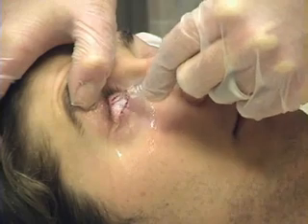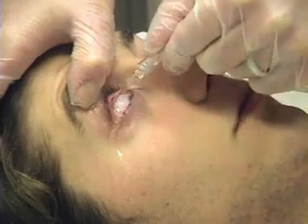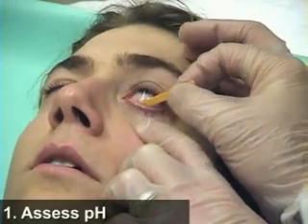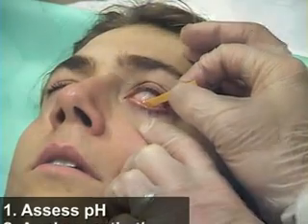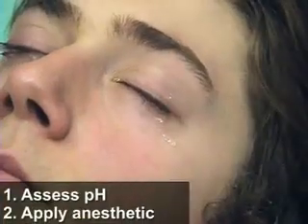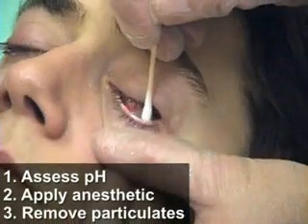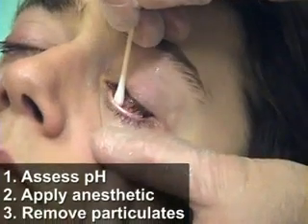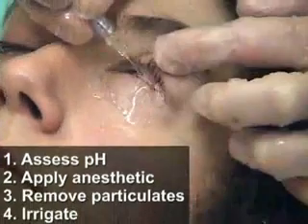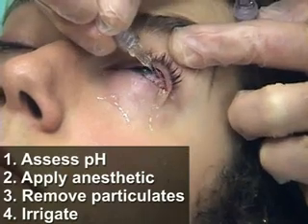Remember the key steps to irrigation: assessment of pH prior to irrigation, application of topical anesthetic, removal of particulate matter with a cotton-tipped applicator, and copious irrigation with normal saline solution.